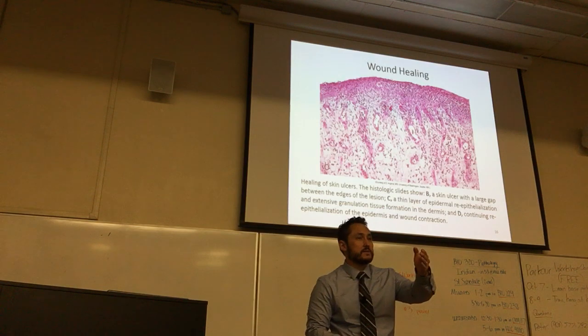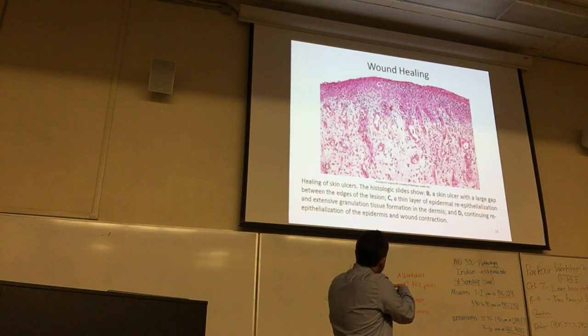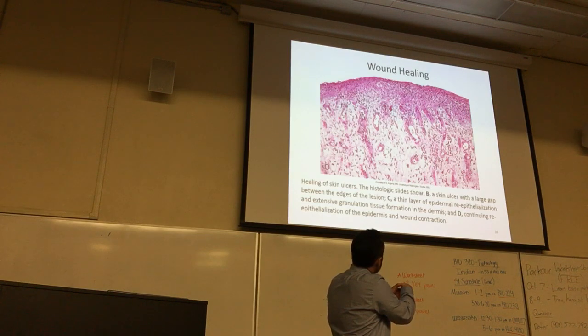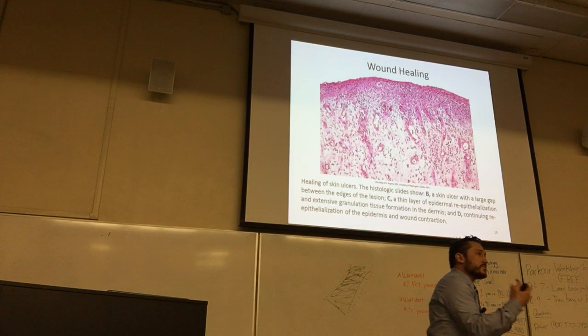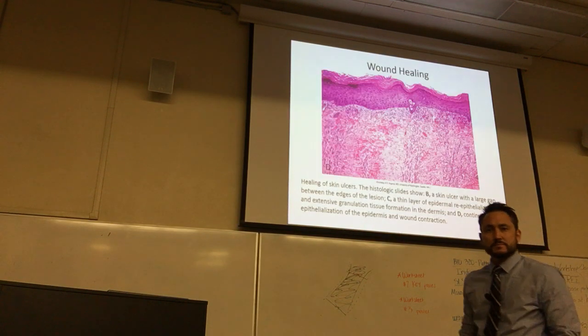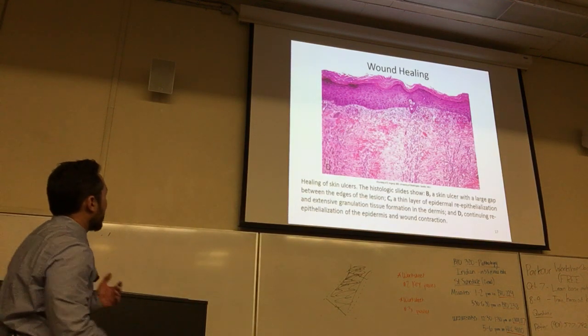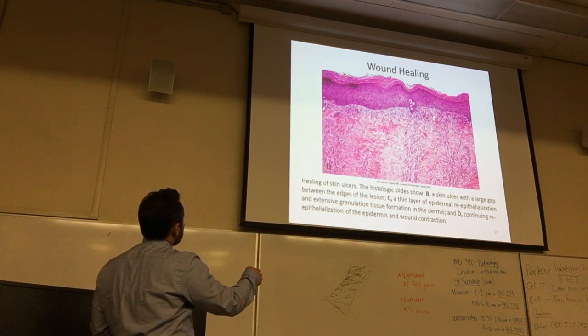Blood vessels. Who said that? Blood vessels. In fact, in this one you can see a red blood cell right in the middle, waving at you. They don't have arms, but they did. Here's another one. Red blood cell right in the middle of the lumen. Here's a stack of red blood cells. So all of this vasculature shows up in granulation tissue because that's the nutritional flow into the wound to try to promote healing.